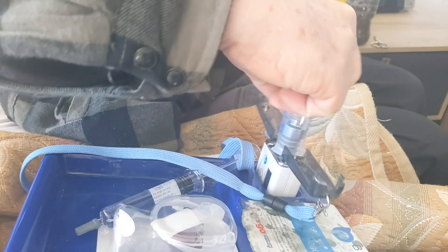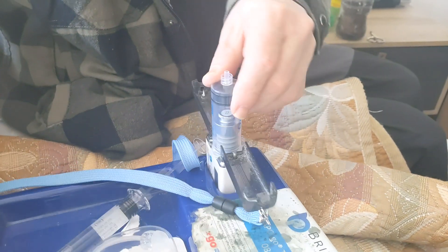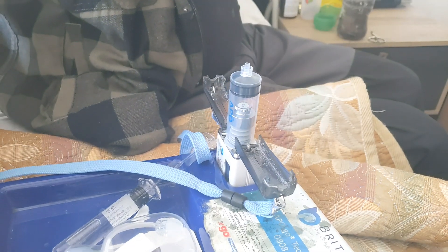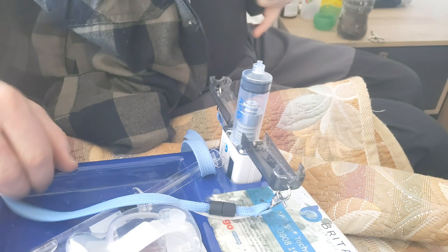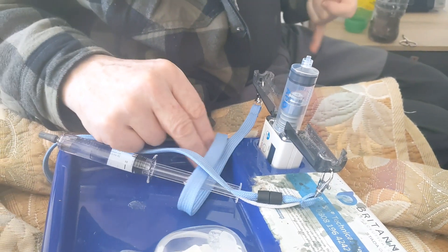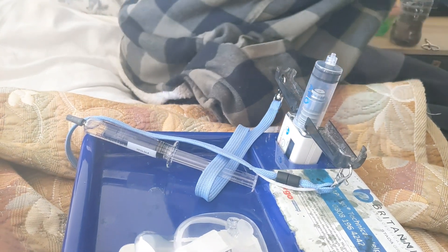We rotate it like that until it clicks into place. Then we look for a part — I think it's in here.